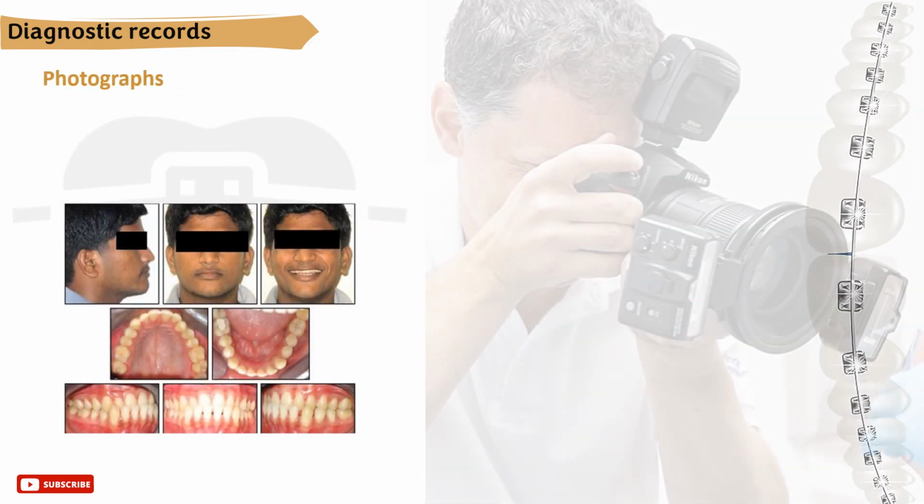Photographs in orthodontics. You should get familiar with using a professional camera, setting up the settings, the flash, and also using the different tools that help you to take an intraoral photograph like occlusal mirrors, retractors, and contrasters. Photos should be of good quality and in color, of course, and they should include intraoral and extraoral photographs.